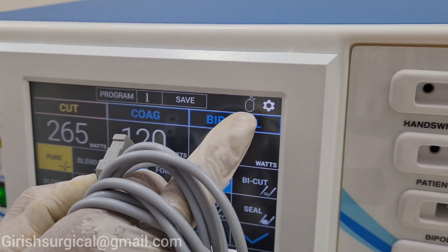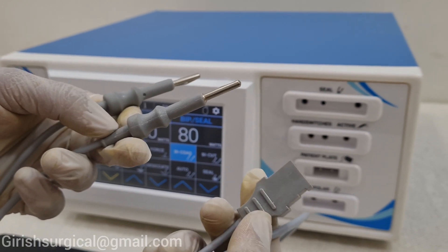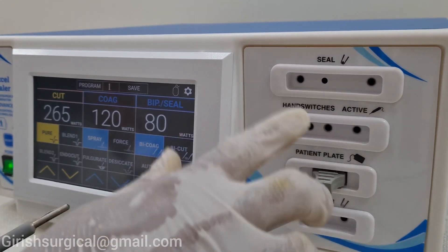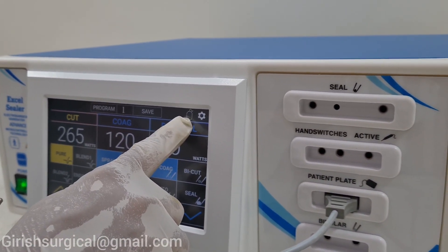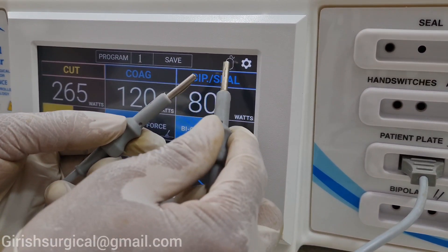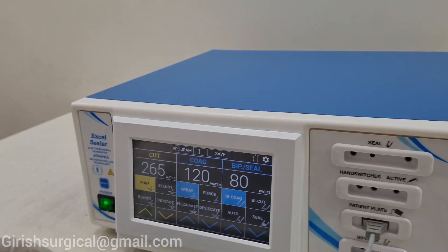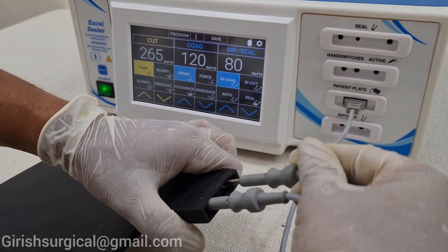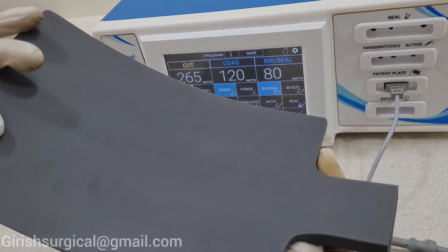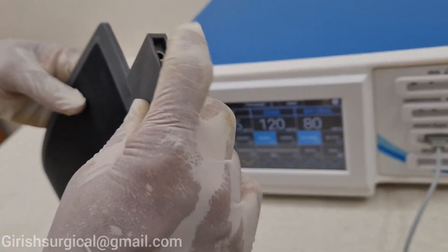Now here you can see the sign of the patient plate, which is indicating completely black right now. This is the silicone reusable autoclavable patient plate cable cord — we will be inserting it into the patient plate port. Even after inserting the patient plate cable cord, the machine indicates it is not connected properly because the two pins are not connected to each other. Now if I connect them, you can see this sign will become white. If I leave it, it is black; if I connect it again, it is white. These two pins need to be inserted into the patient plate.